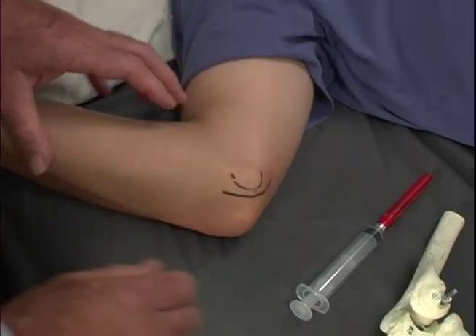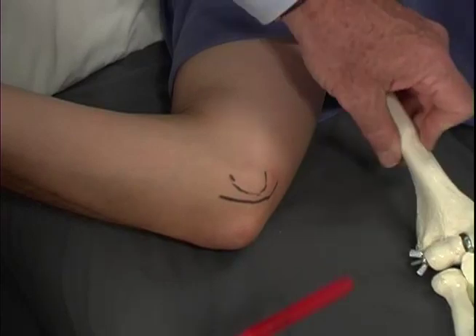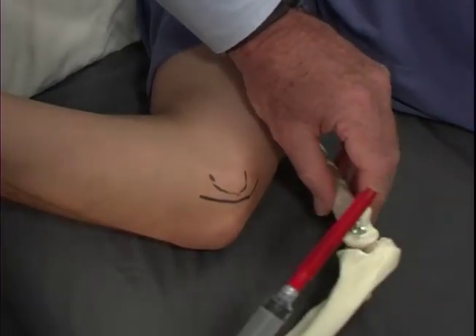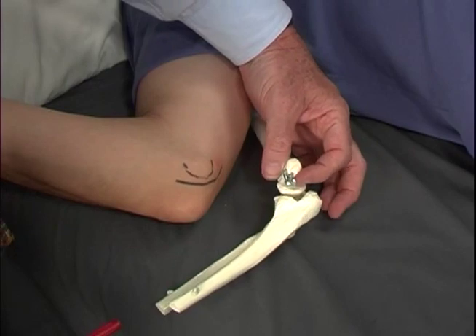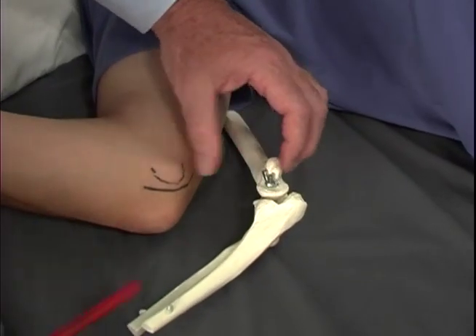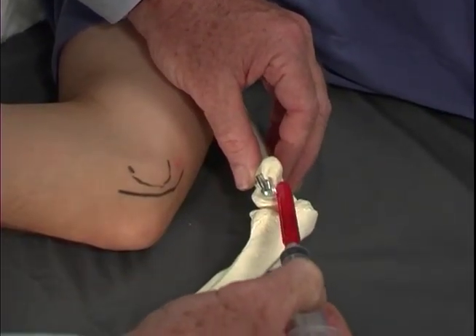And so to guard against injecting that ulnar nerve, I generally hold my fingers right on the epicondyle and then place a finger actually in the groove so that I'm not going to slip my needle off into the groove and inject the ulnar nerve.